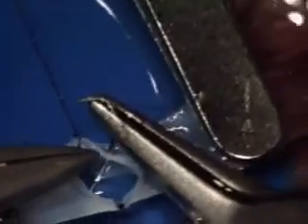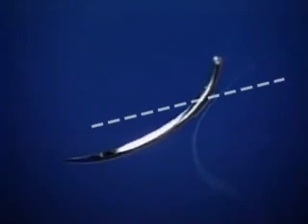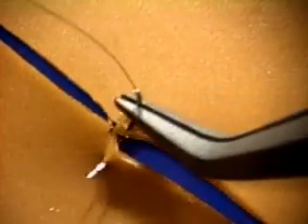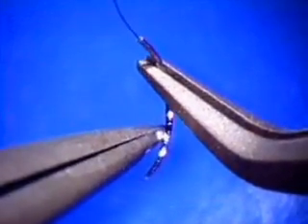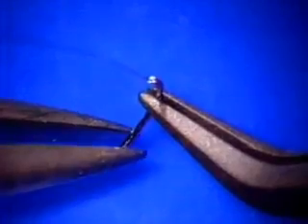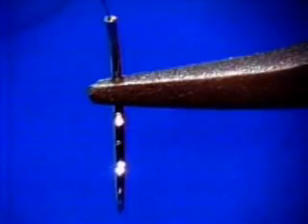In vessel surgery you particularly don't want a downward tilt — that's a sure way to hit the back wall, and that's a disaster. The third and fourth points: holding the needle squarely in both axes is important because that's the only position in which it'll hold steady when you push it. If it's tilted on its horizontal axis it'll capsize; if rotated in its vertical axis the same thing will happen. Hold it square in both planes and it'll go where you want it to go.